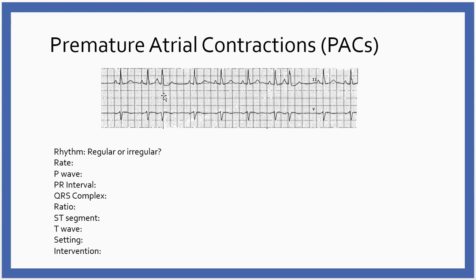The only time, just to let you know, sometimes patients will have increased frequency of PACs before they go into either atrial fibrillation or atrial flutter or something called paroxysmal atrial tachycardia. So sometimes it can be kind of a harbinger of things to come. But for the most part, figure out what the problem is and fix that. Common ectopy.